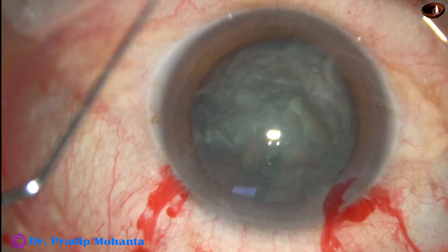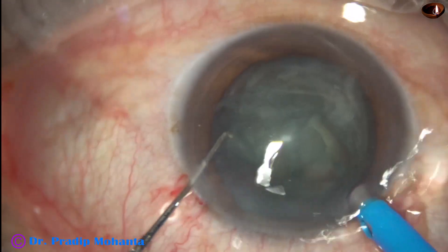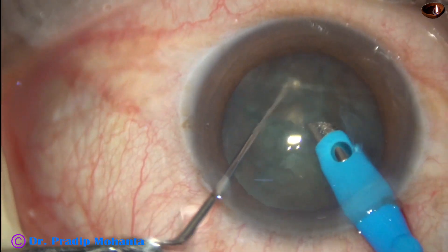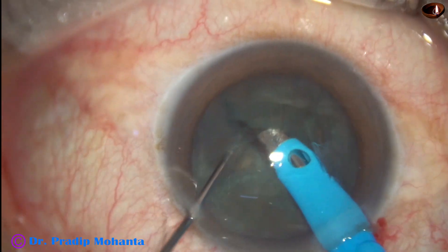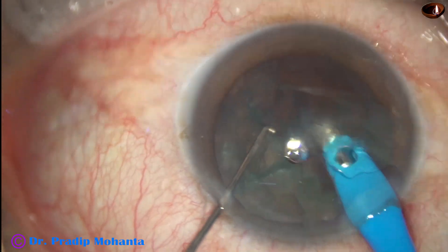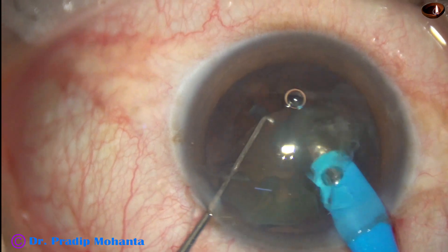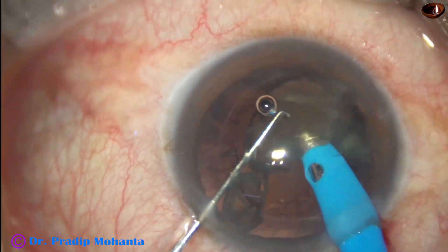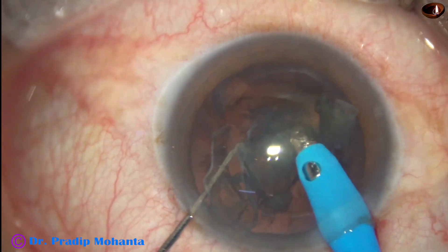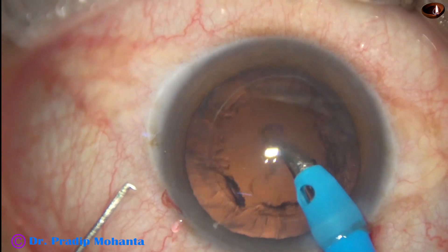Visco is again injected into the anterior chamber. Now the PHACO needle goes in with its bevel down. Some cortical matter is removed, then the pieces are picked up. It is so easy once you divide the nucleus into pieces. In a few seconds, the nucleus is managed.